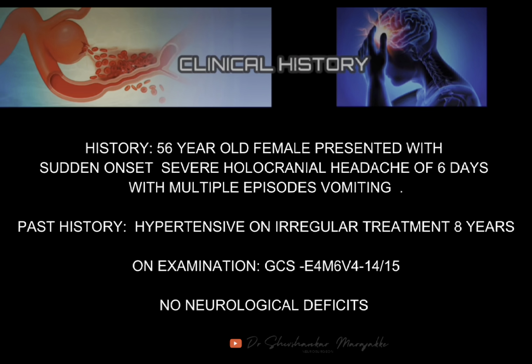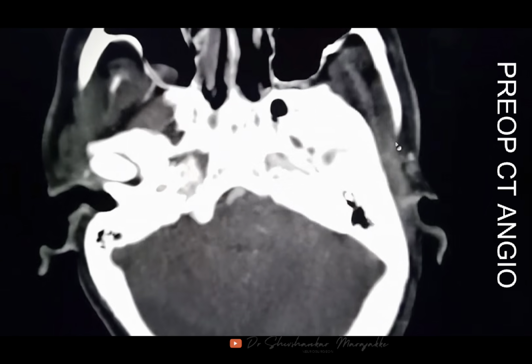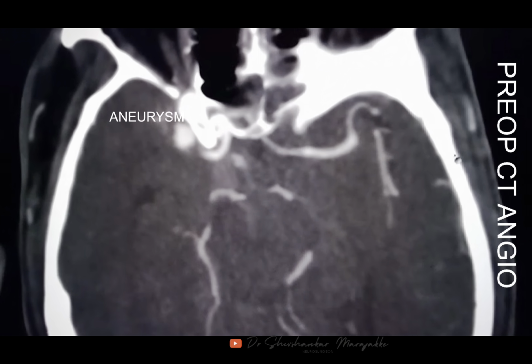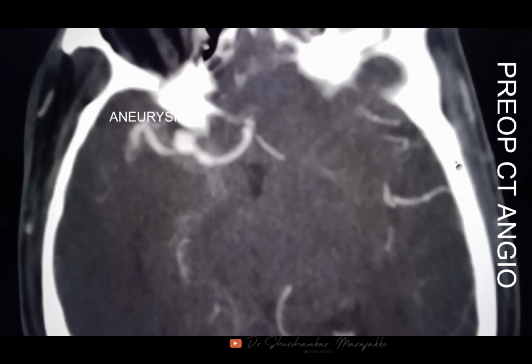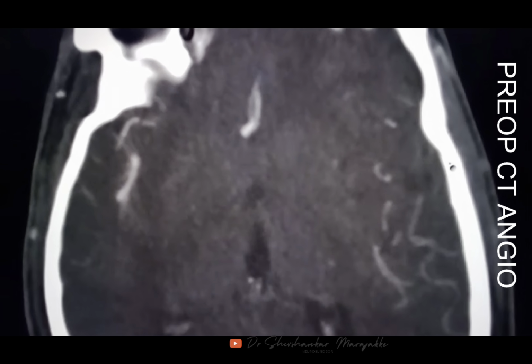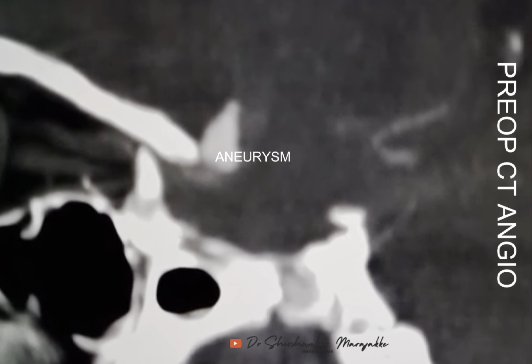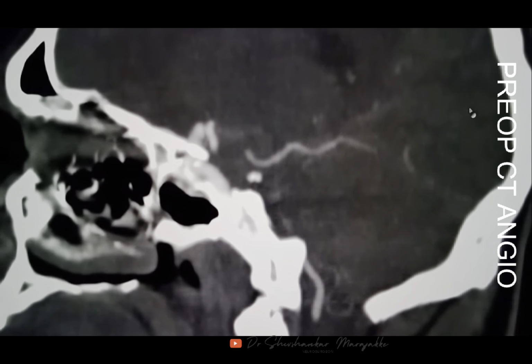So this is a CT angio. Here you can see the axial view. There is a wide neck aneurysm seen behind the clinoid. The ACA and MCA you can see arising from it. There is a mild SAH in the sylvian fissure. This is a large aneurysm arising from the M1 segment of the MCA.